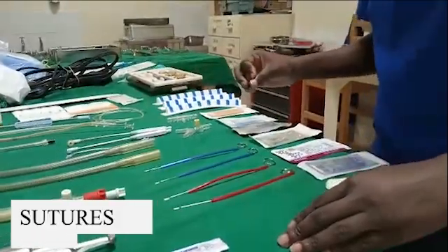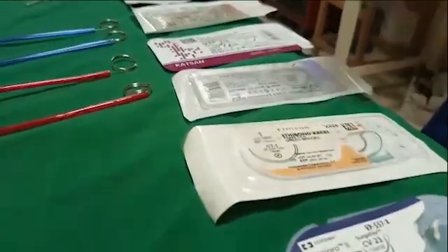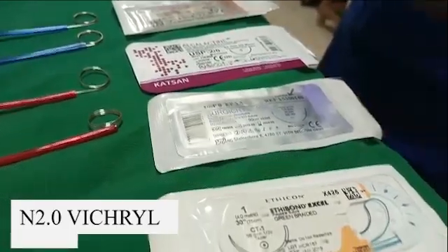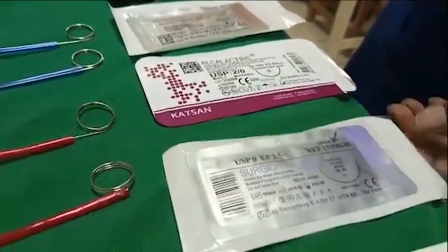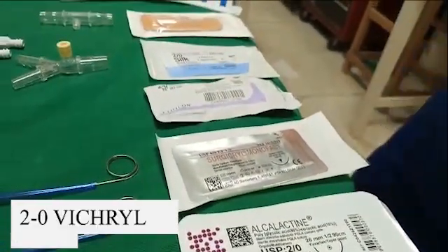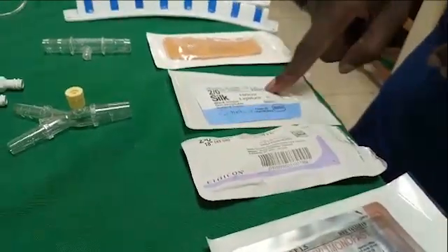We have different sutures starting from here. This is 4-0 Prolene on a smaller needle RB1. This is Ethibond suture number one, we use for retraction. We have number 0 Vicryl, which we use to close the fascia. We also have 2-0 Vicryl, which we use to approximate the subcutaneous. We have 4-0 Monocryl, which we use for the closure of skin. We have 2-0 Vicryl ties and 2-0 silk ties.